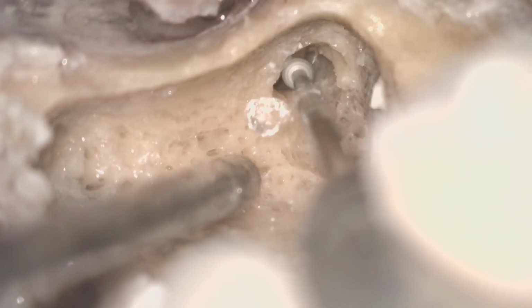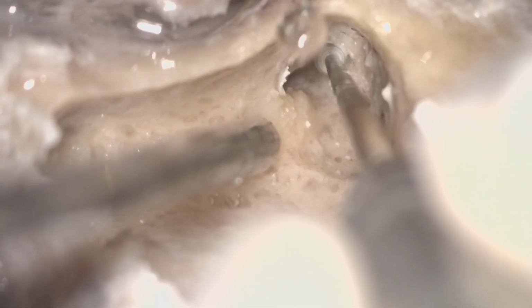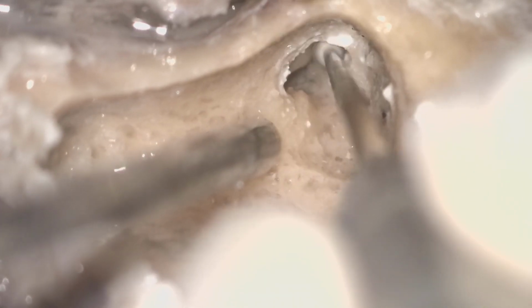You can also use a small cutting bar in that region, but I prefer to use a diamond bar very close to an important landmark like the ossicular chain here. If there is a slippage of the bar, you can definitely injure the structure, but if you have a diamond bar, the chances of injury will be lesser in comparison to the cutting bar. So whenever you are very close to an important structure, always shift to a diamond bar.